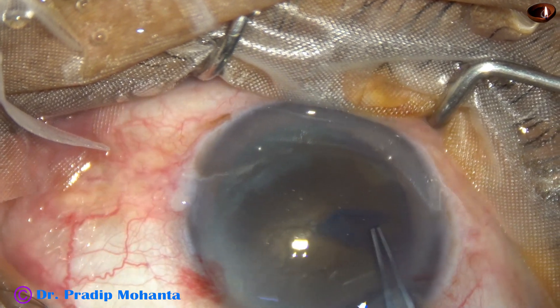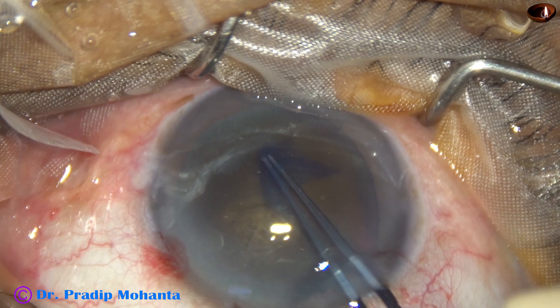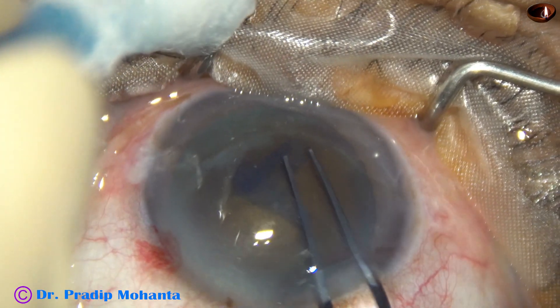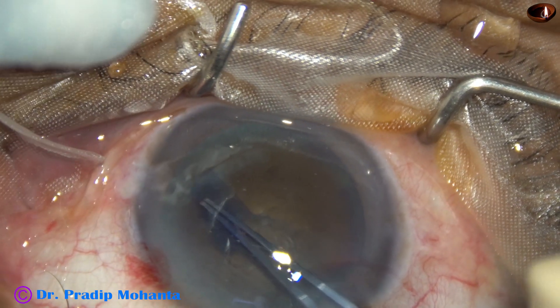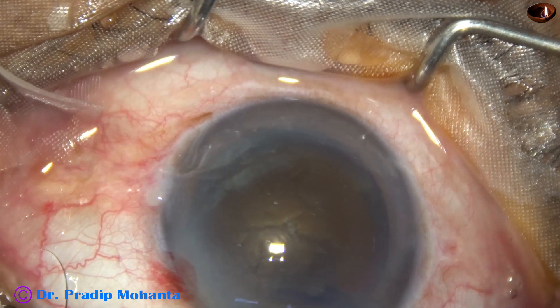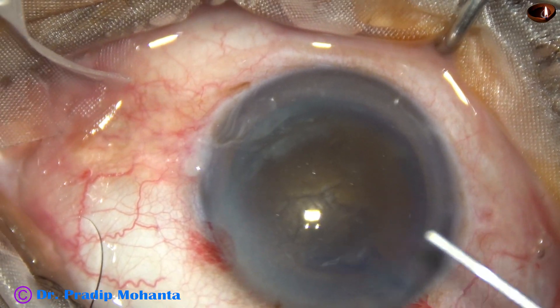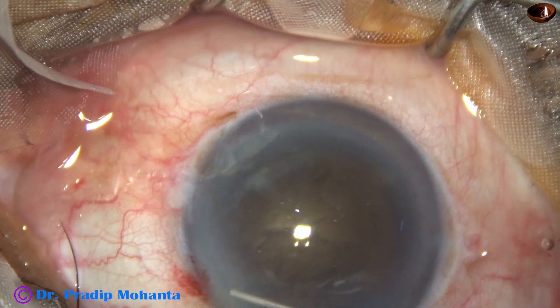The size of this rhexis is about 6.25 mm. Since the cataract is almost black and very hard, I want to do a large rhexis. Nucleus management will be easier. Zonular stress will be much less if I do a large rhexis.